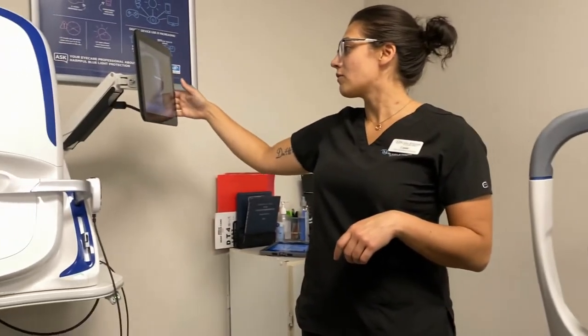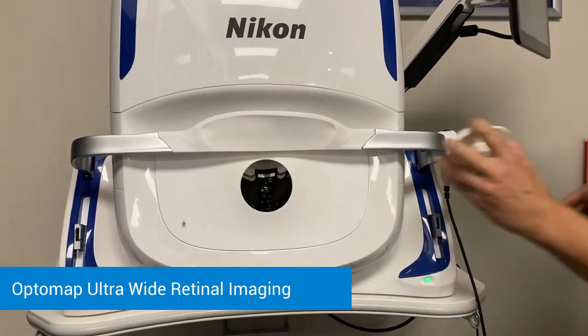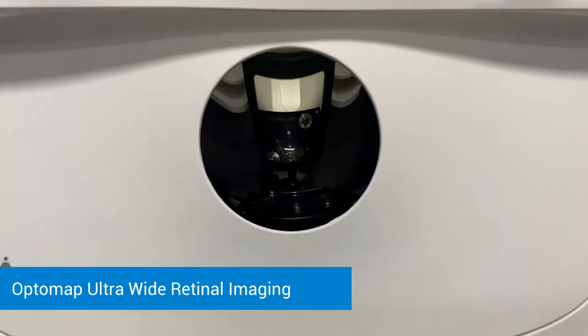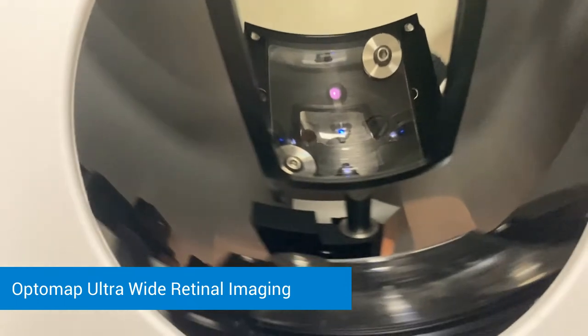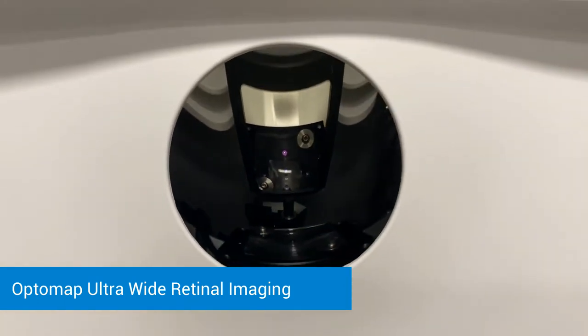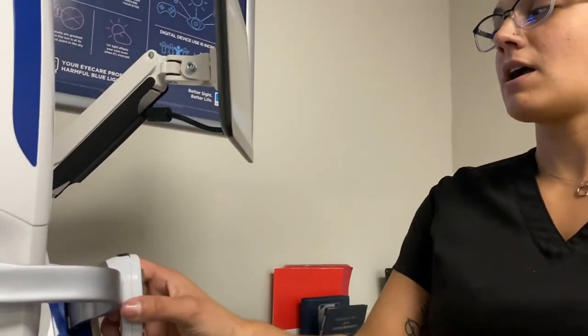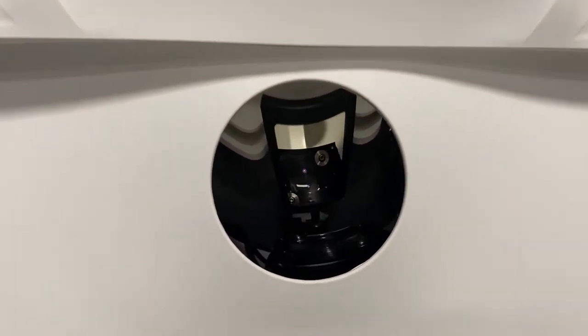Second to last, we're going to come over to the OptiMap here. This is going to be the photo we get of the back of the eye — this way the doctor can see the peripheral area of the retina and the health of the optic nerve and the vessels. You're going to slide the chair all the way forward and we're going to look in there with one eye at a time. Turn the chair slightly to the right, look in with your left eye first, forehead right against the headrest. You're going to see a blue target in the center — once we get that in your center of vision, open nice and wide, and you're going to see a big flash. Then we'll move on to the next eye.